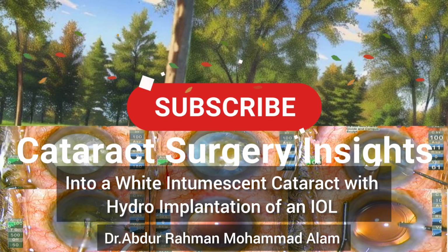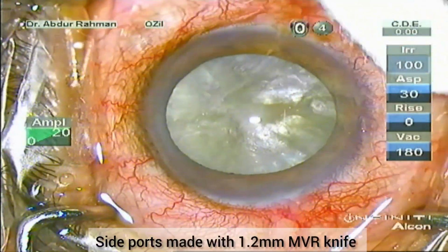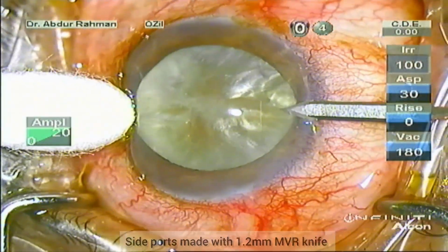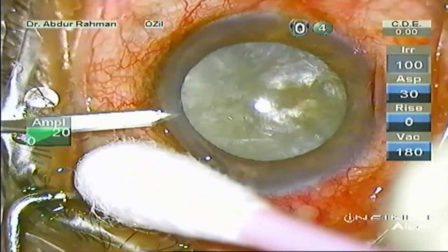Welcome you all to today's cataract surgery insight into white intumescent cataract with hydroimplantation of an IOL. I'm going to make two side ports on the right side and the left side with a 1.2 millimeter MVR blade.